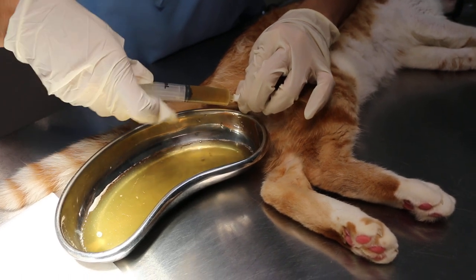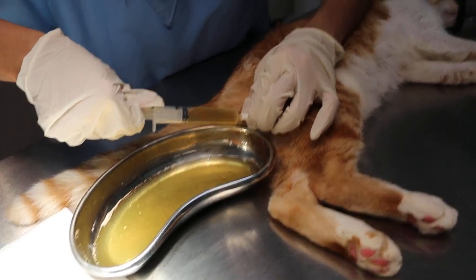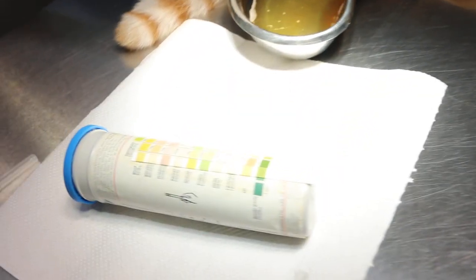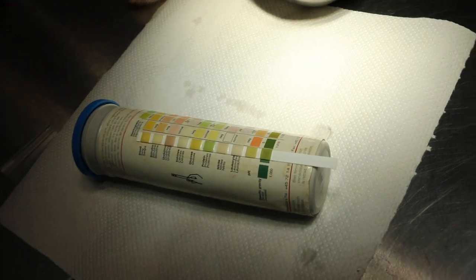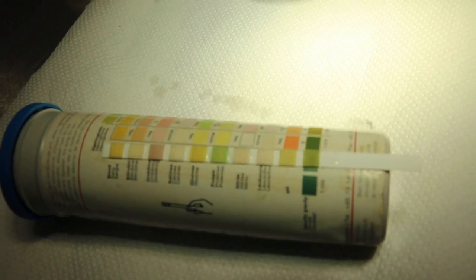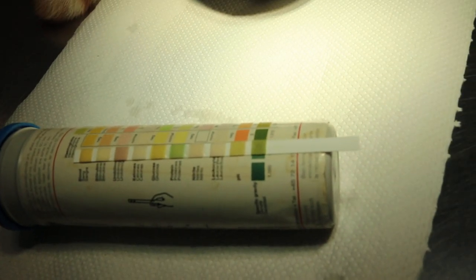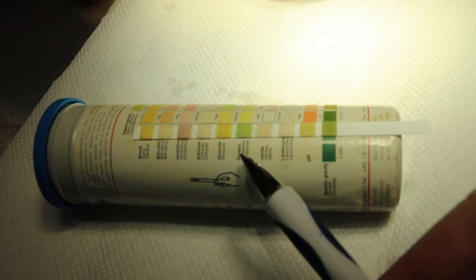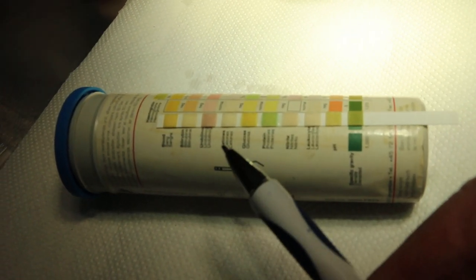Sorry? 100 ml. Yeah, I'm surprised there's so much urine. Now, we did a dipstick test, and this shows that there's no blood, and it's alkaline urine, pH about 7 to 8. And there is protein, you can see by the green, there is protein inside, there is no glucose.